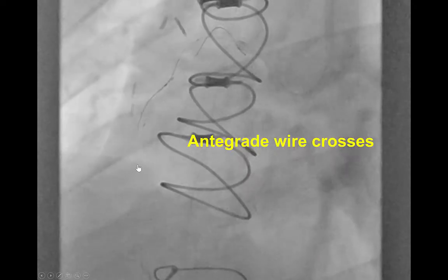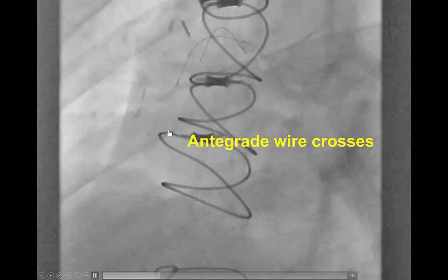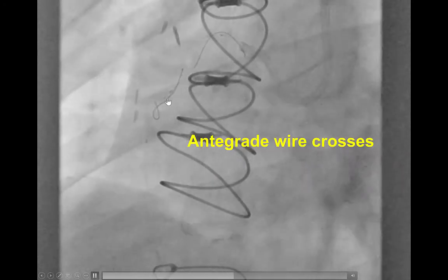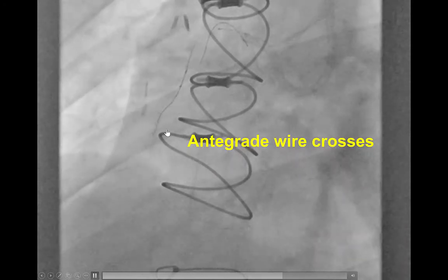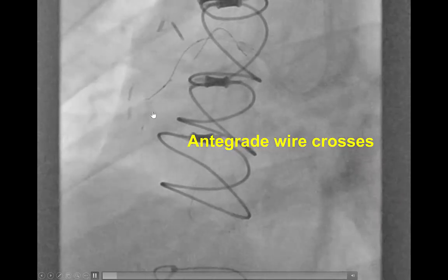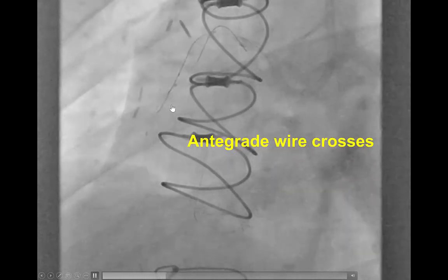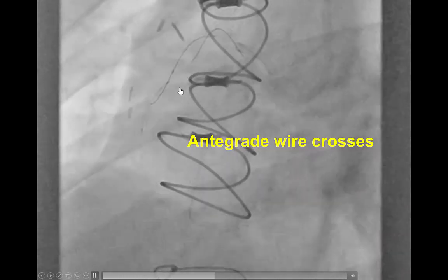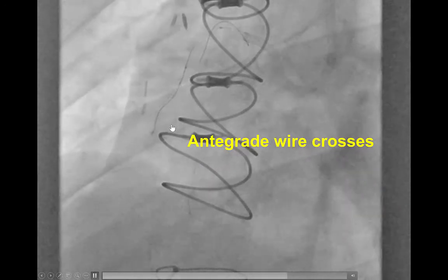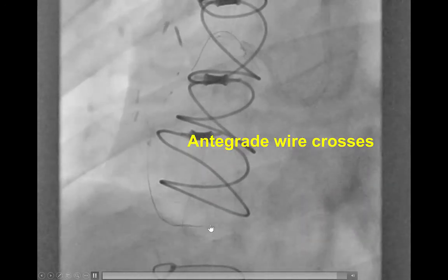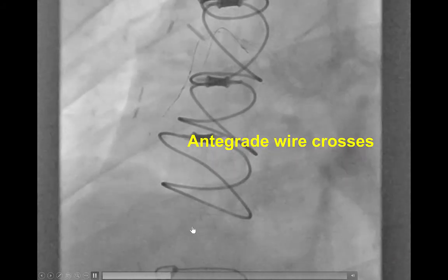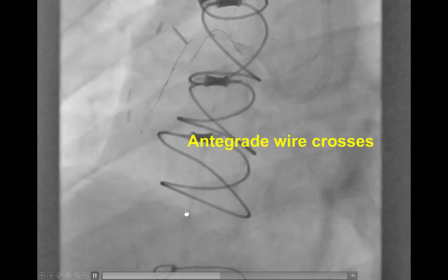After doing this, we then used the so-called CART technique, in which an antegrade wire is advanced trying to take the space created from inflation of the two balloons. After some attempts going into the subintimal space, the antegrade guide wire did take the course into the distal true lumen, and now it's advancing easily adjacent to the retrograde microcatheter and guide wire.